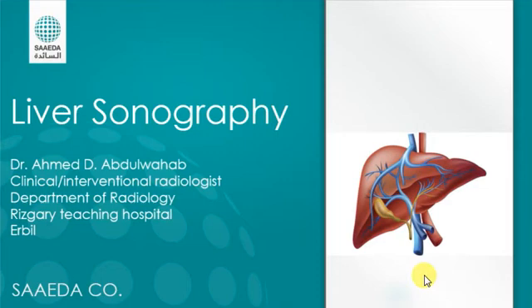So, regarding liver sonography, it's a huge topic to be presented in a limited amount of time. I hope I can finish this before you fall asleep. I will try my best. Okay.